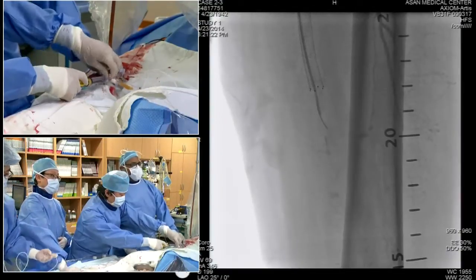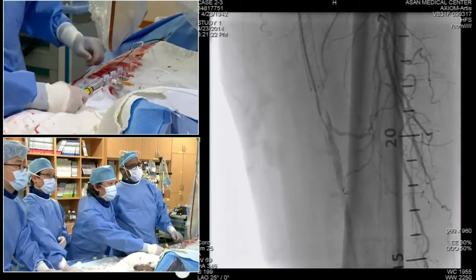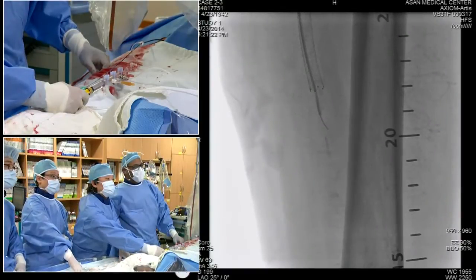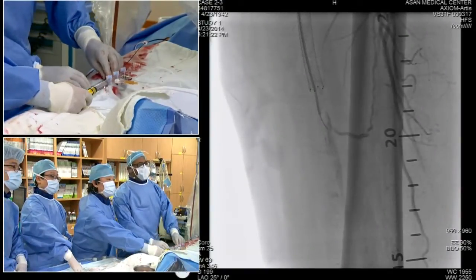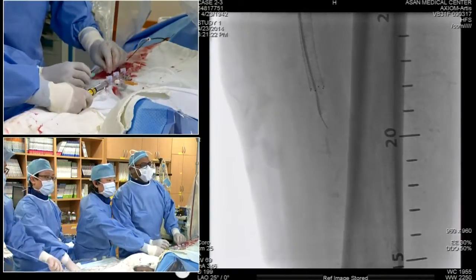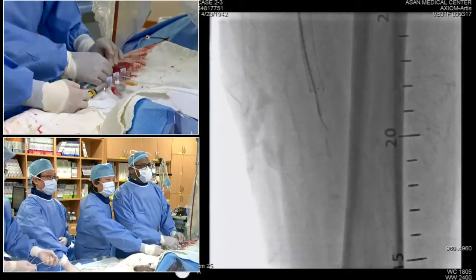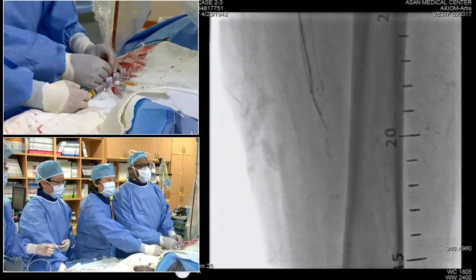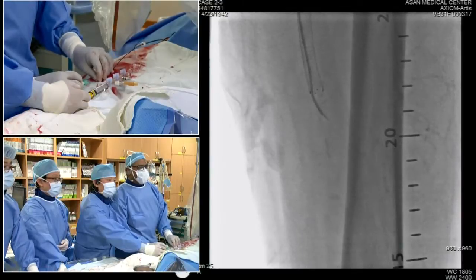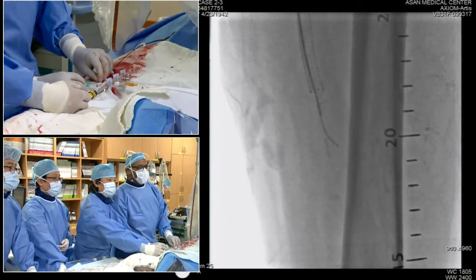Bring that up for me as a mask on the screen above, please. Yeah, I agree. Those actually are pretty good wires for this type of case. Very good. Thank you very much. So what we're going to try to do is align our catheter with our wire. And having this challenge here, give me a little puff here.